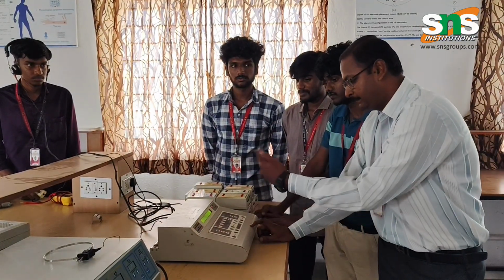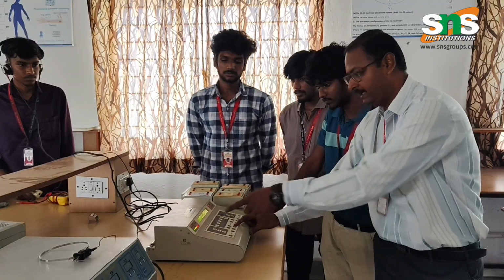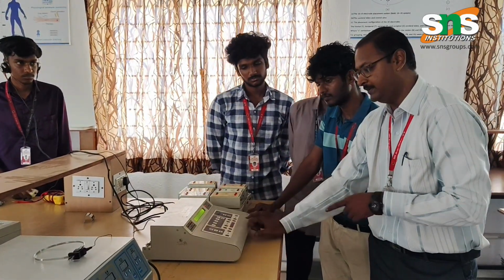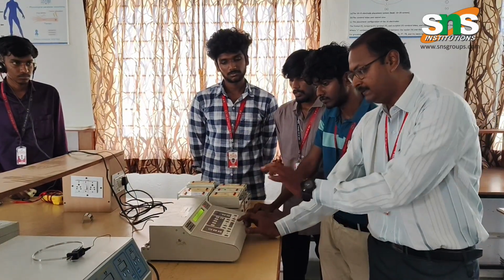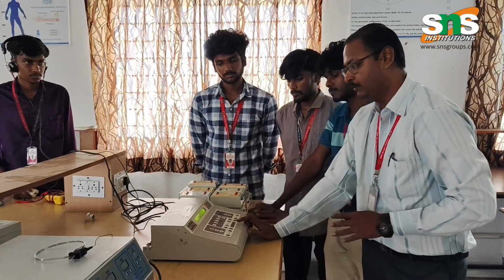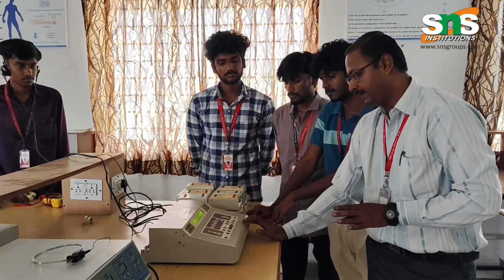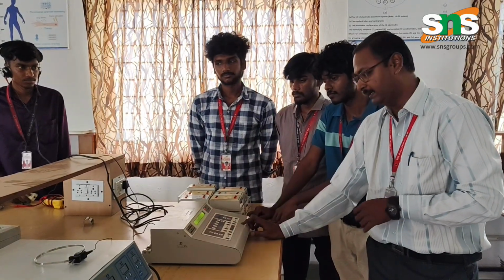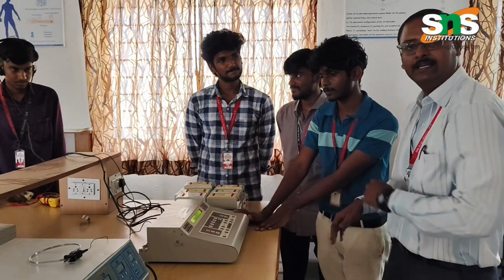If it is not heard by the patient, we try one more time. You can see the light glowing on the machine, and if I take my finger off this button, it goes off. It is like a push button: when you press it, at that instant the sound will be heard by the patient. If it is not heard, you increase the level of your sound, for example to 50 dB. This process has to be done continuously until the patient gives a response.